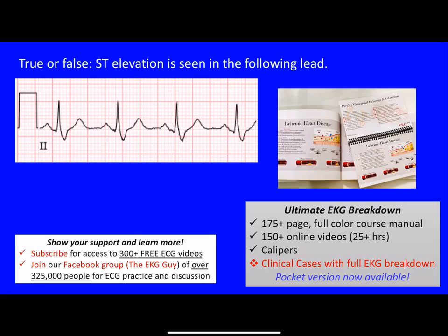Welcome back. Here we have a true or false question that states: is ST elevation seen in the following lead? We have Lead 2 here — Lead 2 is an inferior limb lead. The question is asking whether there is ST segment elevation, so one thing you have to know is what is the ST segment and how do we measure if it's elevated or not.